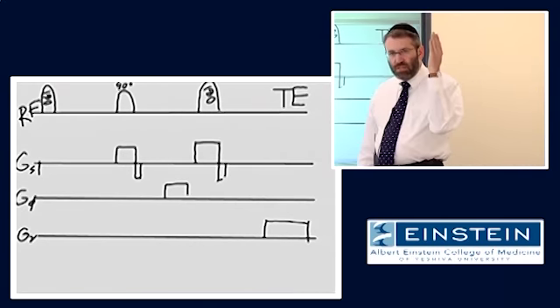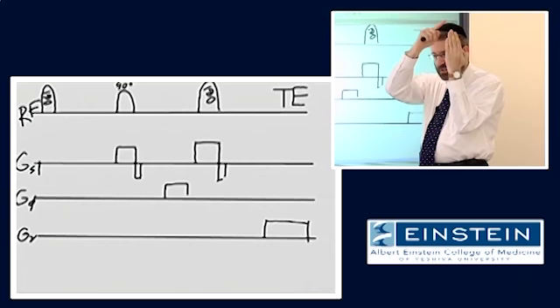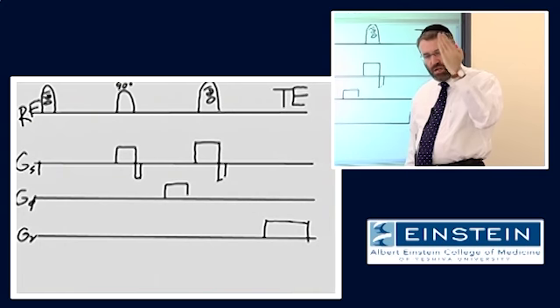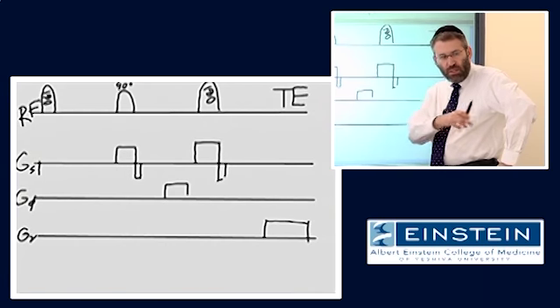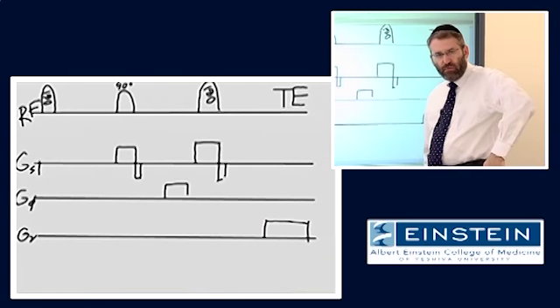Well, we have our magnetization, which if the B0 is going from floor to ceiling here, it's at rest. When we give it a 180 degree RF pulse, it rotates down to 90 and keeps going until it is inverted from where it was at rest. That's the definition of a 180 degree RF.